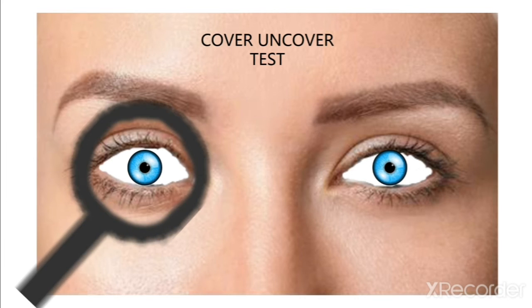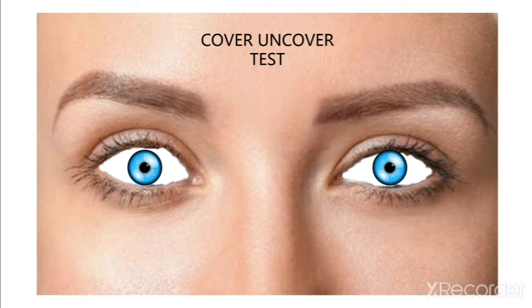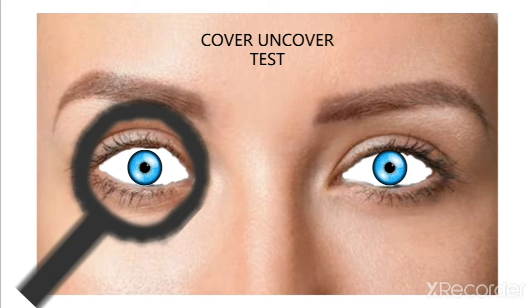Okay, so we are occluding one eye, and if there is any strabismus in the eye which is under cover, then when the fixation is lost, the eye will turn outward or inward depending on the type of strabismus present in that patient. In this case, again I am showing you, after placing the occluder over her right eye, we can see that the eye is deviating outward, that is exo, so it is exophoria. Okay, so this is how it is determined.